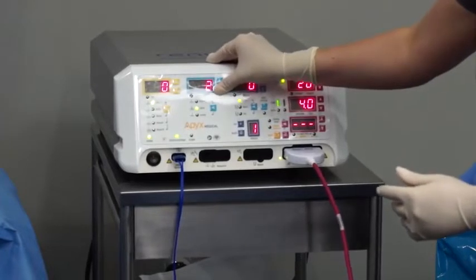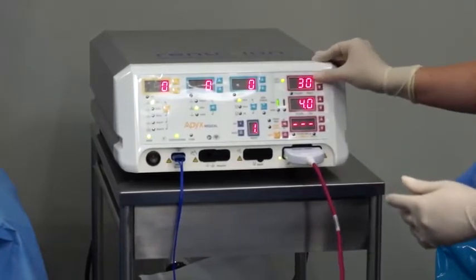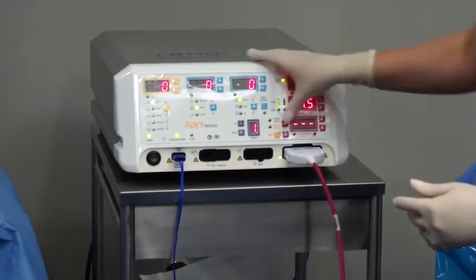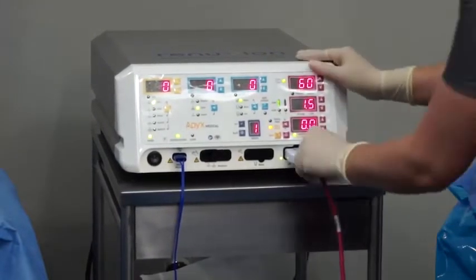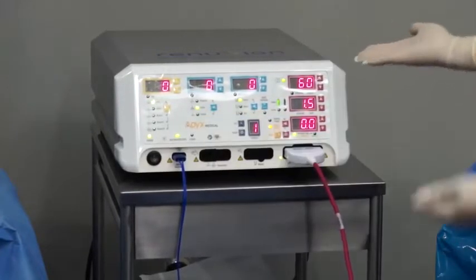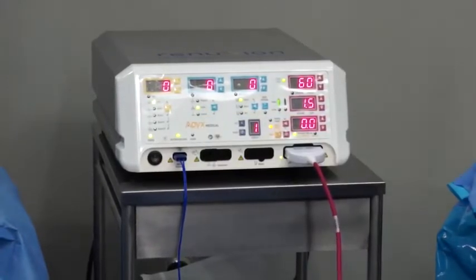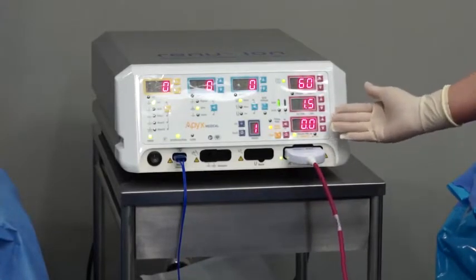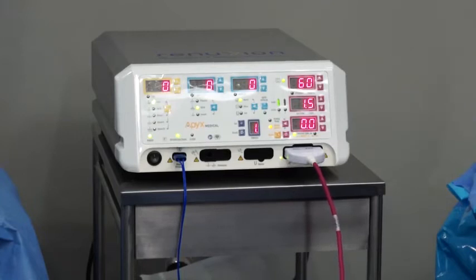And so we're going to go ahead and zero out the machine on the non-Renuvion side, the monopolar and bipolar, and plug in the handpiece into the Renuvion side with a power level of 60% and 1.5 liters flow rate. Below that 3rd level, that 3rd point, is a joule counter, and typically at 60% power to 80% power, you'll have about 1 kilojoule per minute to 1.4 kilojoules per minute. And so it'll allow us to see how much energy we're deploying underneath the skin during our treatments.